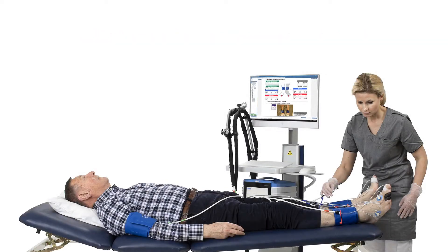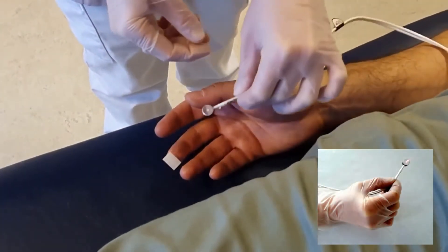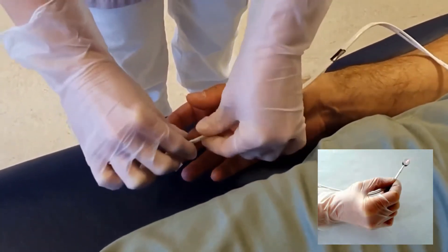The Perflux 6000 system can simultaneously measure brachial and peripheral pressures. The system is equipped with up to six thermostatic laser Doppler probes that locally heat the toes and fingers to 40 degrees Celsius.